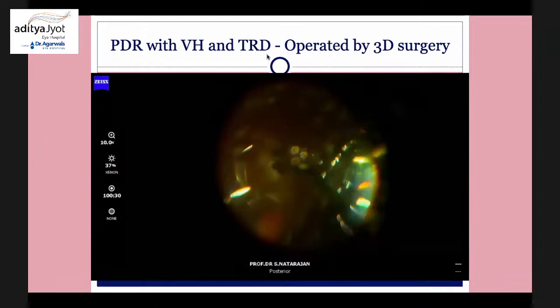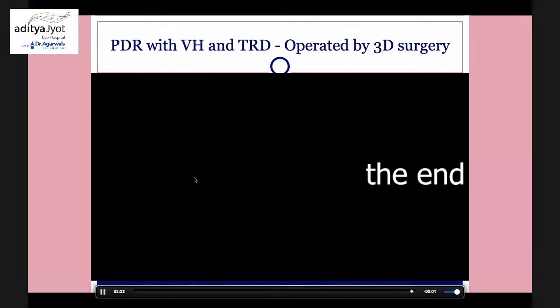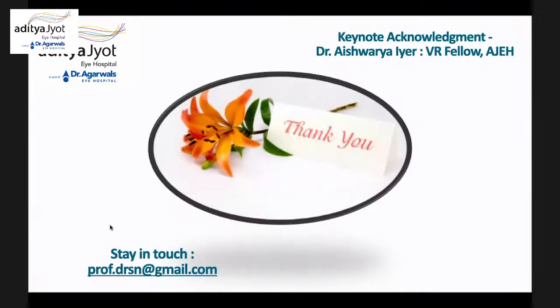So now you can see the eye is filled with gas, the instruments removed, and you don't have to suture. Many of my friends from Europe and US ask, how can you do a surgery without sutures? I've done every surgery this way; not a single patient have I sutured since I started doing sutureless surgery. So you can ask me questions.